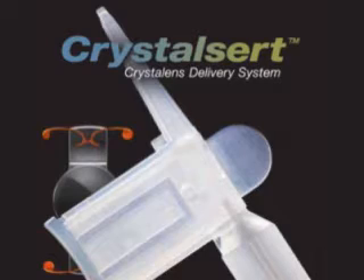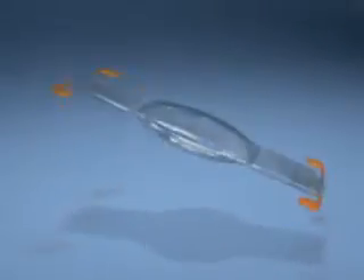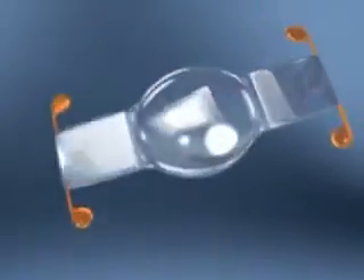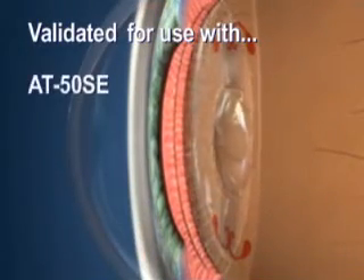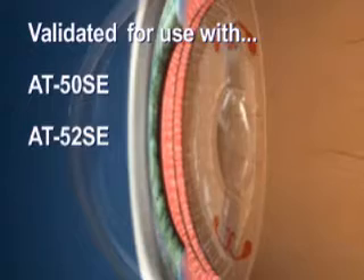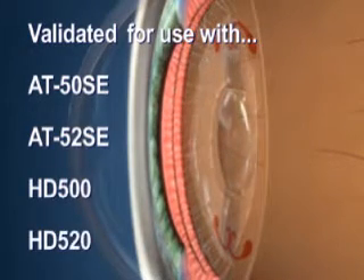The following short video demonstrates the recommended use of the Bausch & Lomb CrystalCert Crystal Lens Delivery System. The CrystalCert is intended to be used to fold and deliver the CrystalLens accommodating intraocular lens into the capsular bag and has been validated for use with the AT50SE, AT52SE, HD500, and HD520.